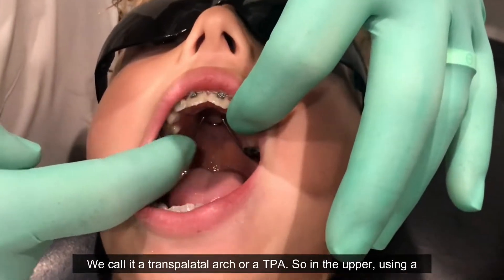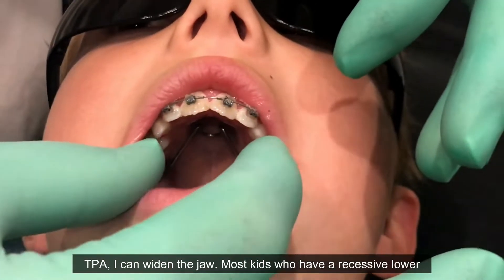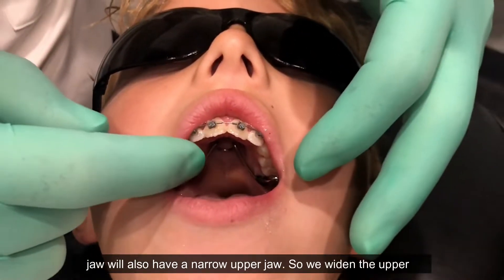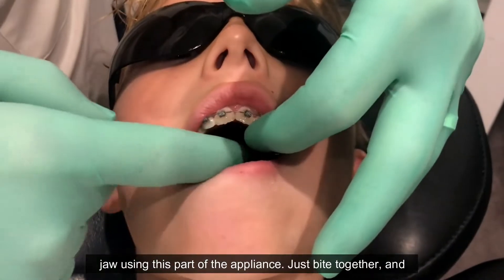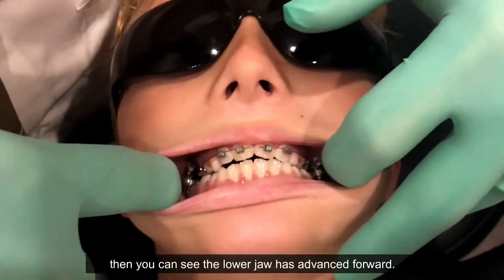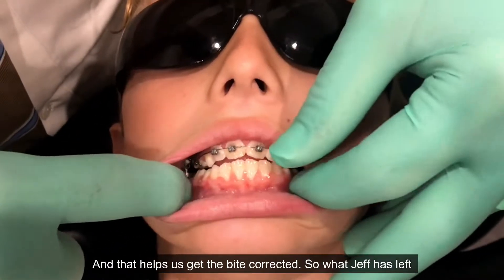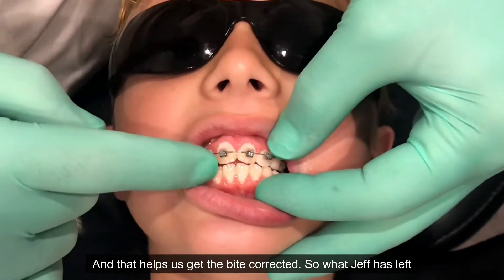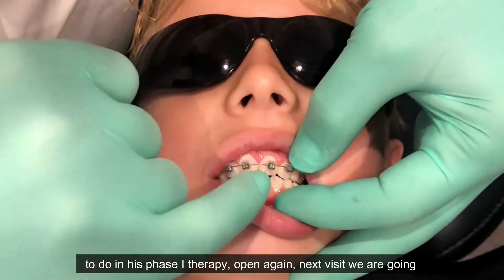Using a TPA in the upper, I can widen the jaw. Most kids who have a recessive lower jaw will also have a narrow upper jaw, so we widen the upper jaw using this part of the appliance. As he bites together, you can see the lower jaw has advanced forward, and that helps us get the bite corrected.